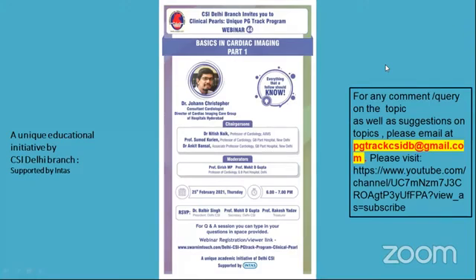This has obviously been developed by Dr. Pennell, who is the pioneer of the T2 star technique in hemochromatosis. He's done a lot of work in Sicily, in the south of Italy, using a mobile MR scanner. Based on that data and now other data from elsewhere, the lower the T2 star values, the higher the iron levels. And as I said before, it allows us to go in for more radical intravenous desferoxamine compared to the oral chelation therapy, and also obviates the need to do repeated liver biopsies like most of us have been doing in our residency time in MD medicine.